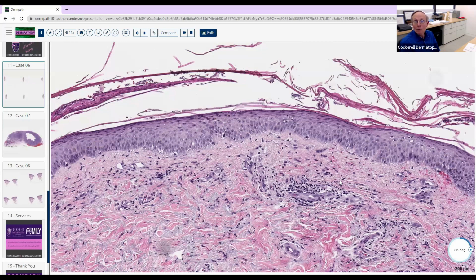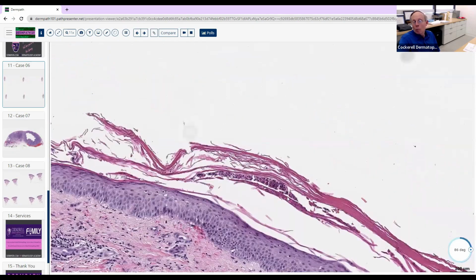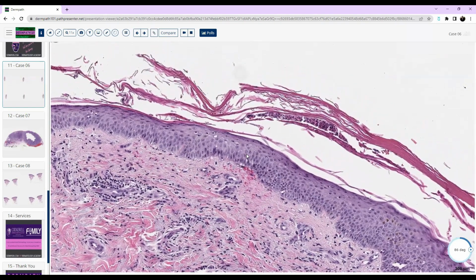And there's a lot of different patterns of dermatophytosis. Can you name a few other histologic patterns that we can see other than this pattern? Would probably just be tinea, maybe tinea corporis. It looks like it's on the trunk here, or maybe the lower leg, because there's some stasis change findings here. Are you thinking along the lines of like a bullous tinea? Good. Bullous dermatophytosis, absolutely. You can get lots of spongiosis, lots of papillary dermal edema. Can simulate a bullous process. We get cases every now and then of suspected bullous pemphigoid. It turns out to be bullous tinea.